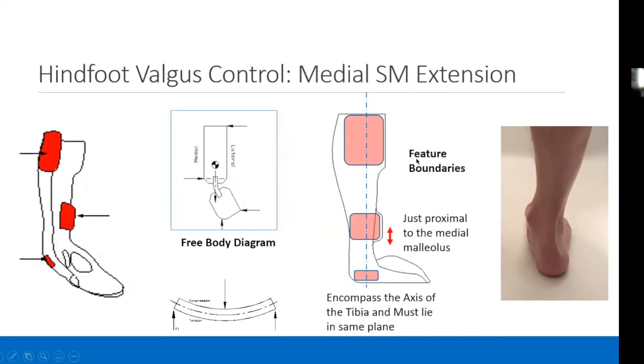And this, in my practice, has proven to be a very effective means to control hindfoot valgus. It is the supramalleolar extension. Some people call it the Savage extension, and even draw a special trim line where the trim line just above the malleolus extends anteriorly. I want to point out a couple of features about implementation of this supportive element. Again, the 3-point pressure system. Here's an endpoint load. Here's an endpoint load. This is the tibia. This is the lateral heel tubercle again.